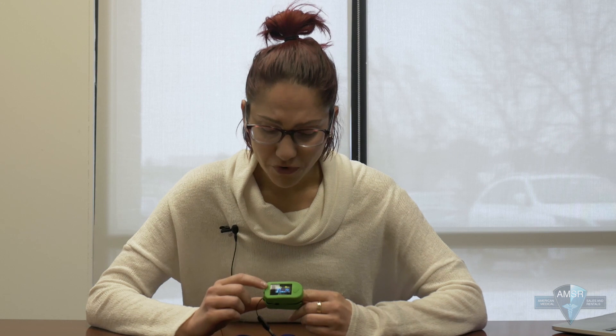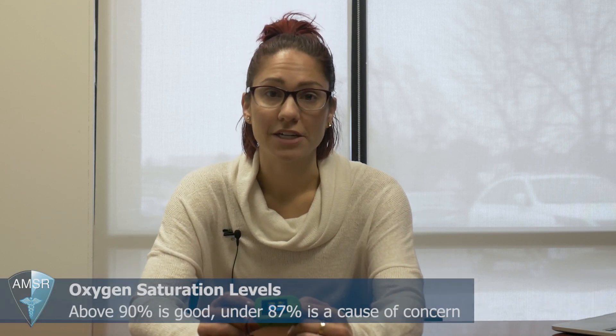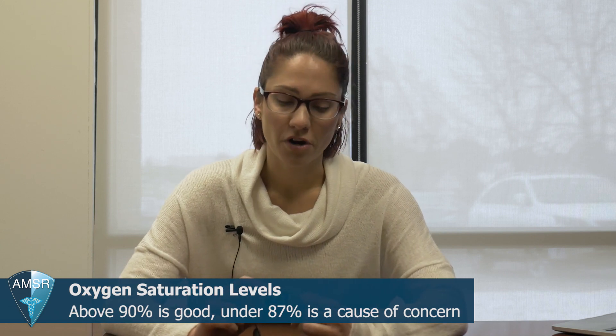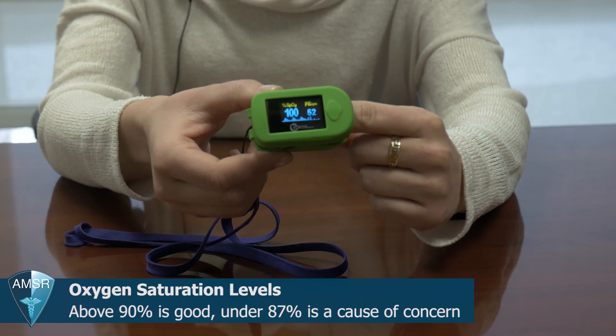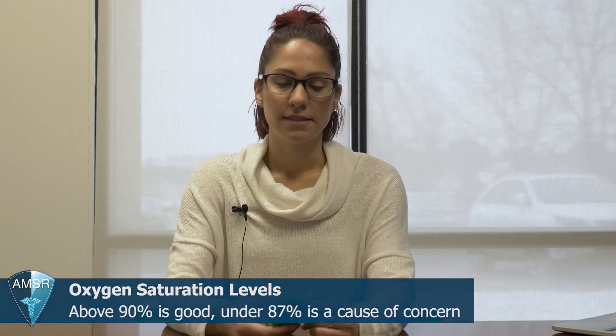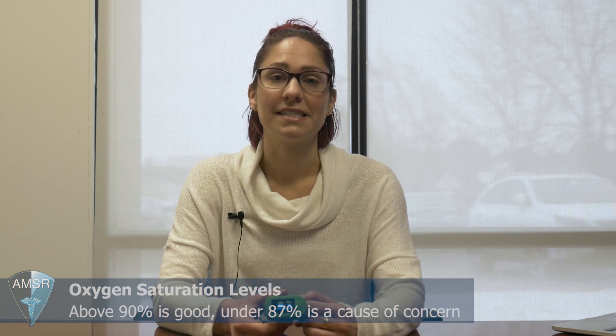Right now you can see that I'm at 97 for my oxygen saturation — that's good, that's above 90. This particular device also measures your heart rate, so you can see that number right there as well. The pulse oximeter is harmless, doesn't hurt, and just takes a few seconds to see exactly where you're saturating.